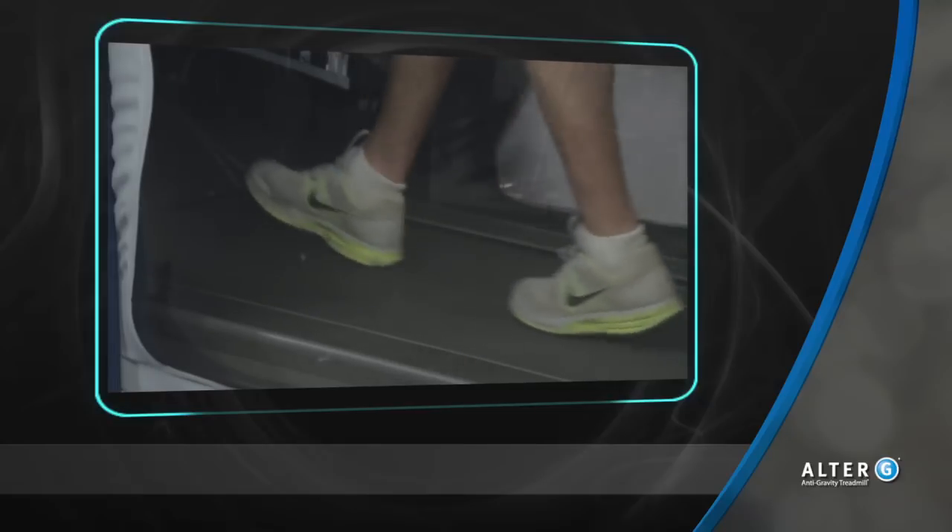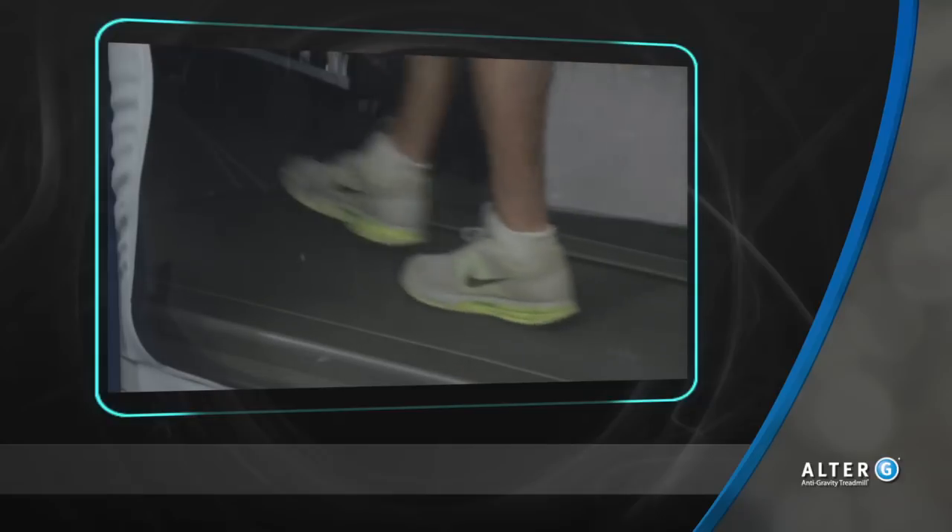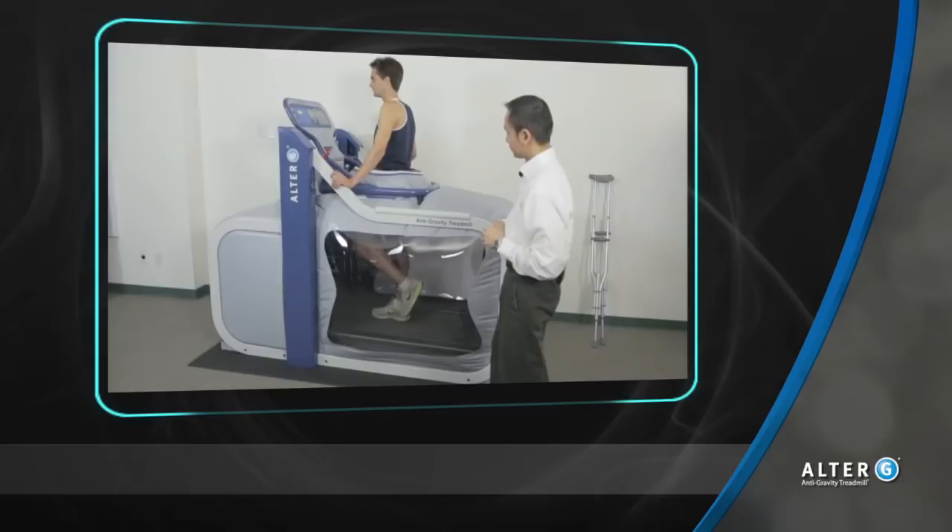The patient can then begin closed kinetic chain, proprioception, or even walking at the proper body weight level. No other option can provide this level of precision to the user in partial weight-bearing situations.